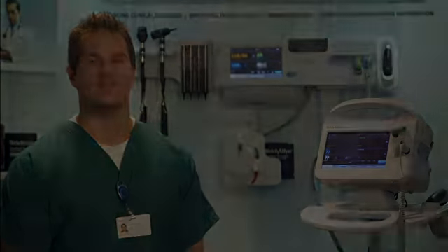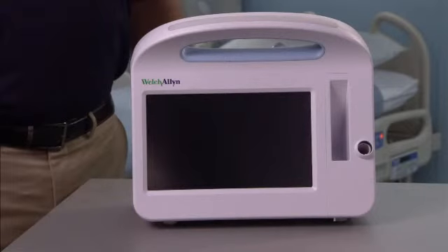Hello, my name is Grant Huff, Clinical Consultant with Welch Allyn. Since it is a brand new device and you are setting up the monitor for the first time, the monitor has no power.